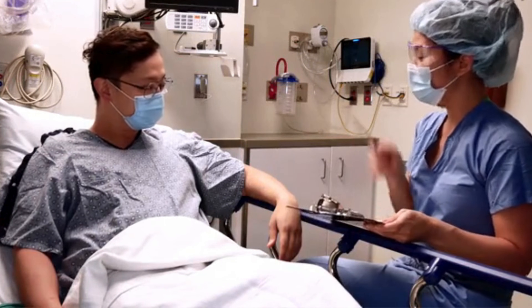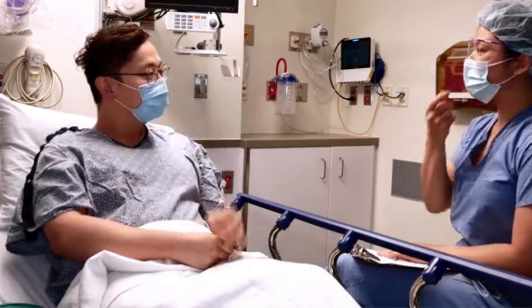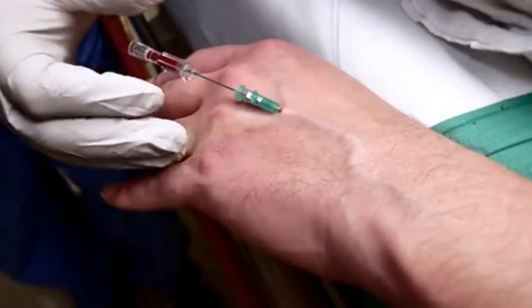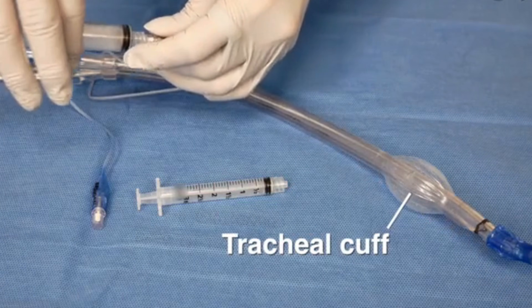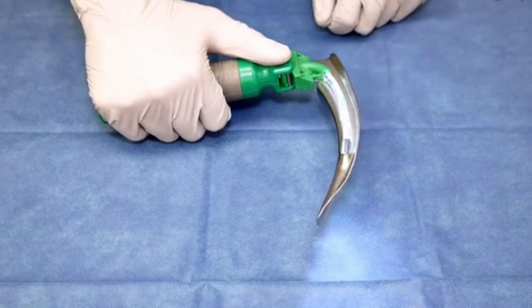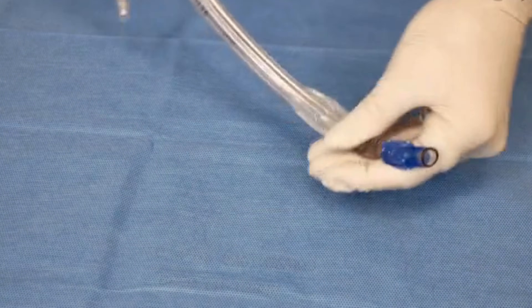Explain the procedure to the patient, including descriptions of the benefits, risks, and possible complications. Obtain written informed consent from the patient or a proxy. Perform an airway examination as done for single-lumen endotracheal intubation. Establish intravenous access and set up appropriate monitoring devices before inducing general anesthesia. Inflate the tracheal and bronchial cuffs and look for any leaks. Prepare the laryngoscope and bronchoscope and confirm that both are functional. Consider shaping the stylet to aid in placement of the tube and applying lubricant to the tube.